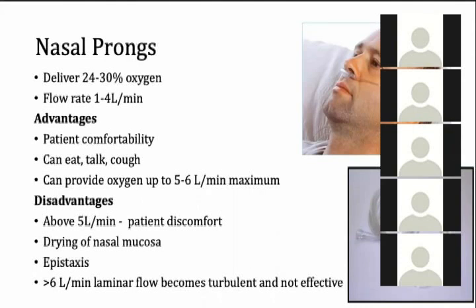One advantage of this device is comfort, and the patient's face is not covered. They can eat, talk, and even mobilize with some aids while on this device.